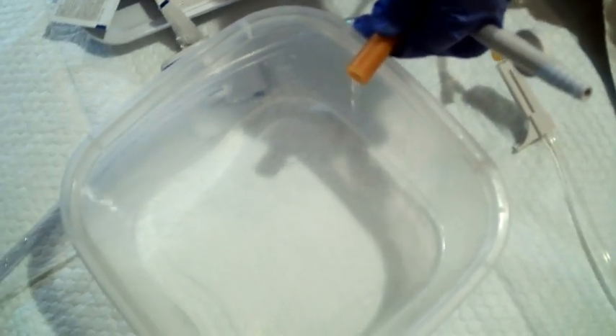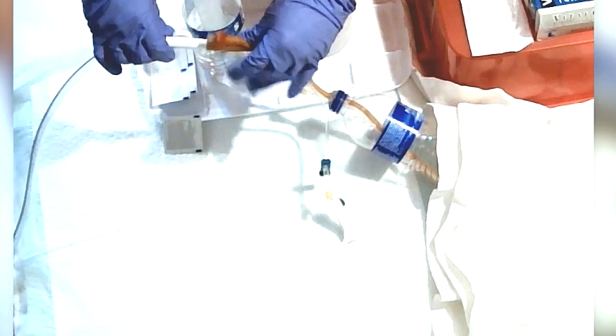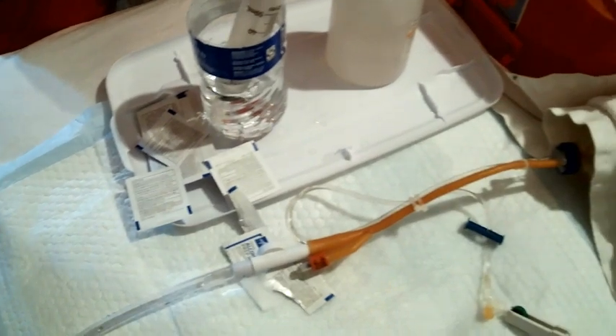And the patient says, 'It feels better. Thank you.' So what we want to do is make sure we don't touch this tip to anything, and that we maintain our sterility. You want to make sure that everything is straight — you always want your Foley tubing to be straight and not kinked, because it will not drain right. Even though these systems are made to be closed systems, they still can backflow and cause urinary infection.